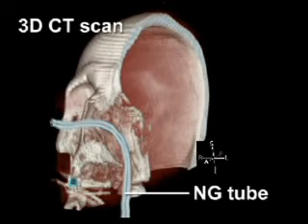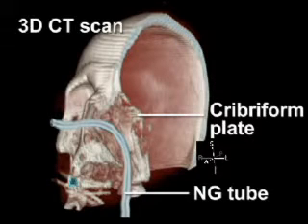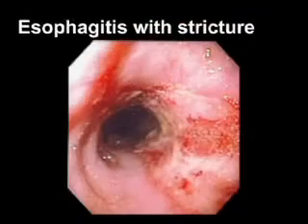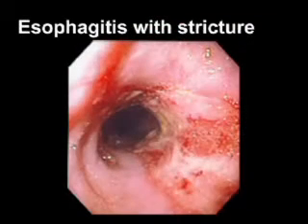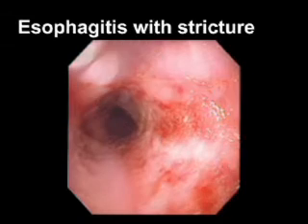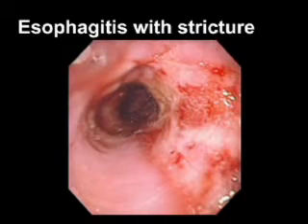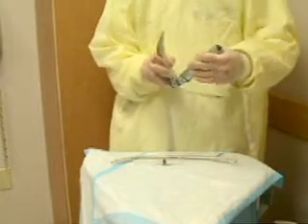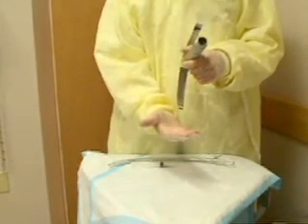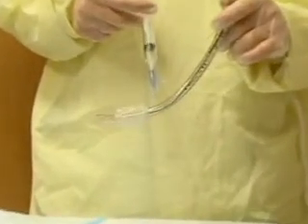Nasogastric intubation should be avoided in patients with significant maxillofacial trauma, as the tube may enter the cranial vault if the thin cribriform plate has been disrupted. The procedure should also be avoided in patients with known esophageal abnormalities such as recent caustic ingestion, diverticulae, or strictures, as they are at high risk for esophageal perforation. Since nasogastric intubation may induce emesis, patients who are unable to adequately protect their airway should be intubated with a cuffed endotracheal tube if the procedure must be performed.